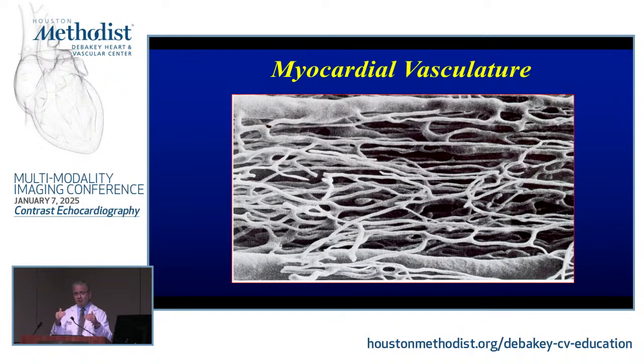It is no longer pulsatile flow. It's almost static flow in the capillaries, moving 1 to 2 millimeters per second, very slow motion. Okay. So we're talking about slow motion of the red cells and blood, inclusive of contrast, and that's why.